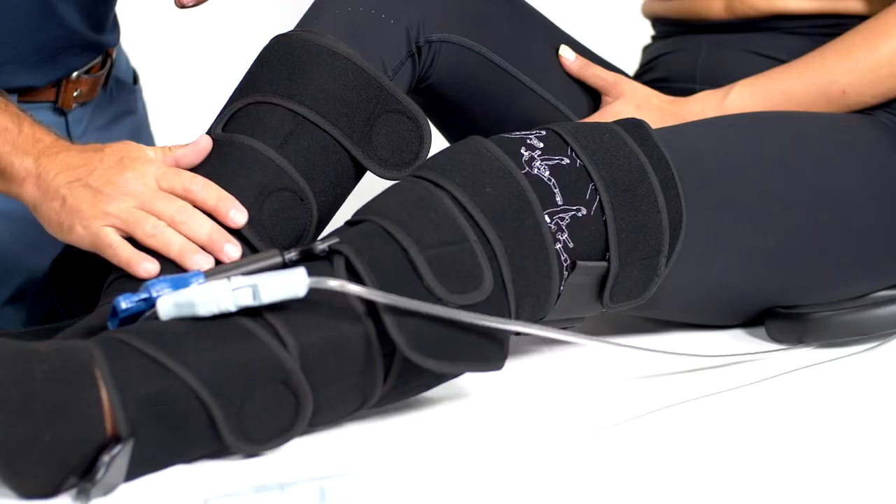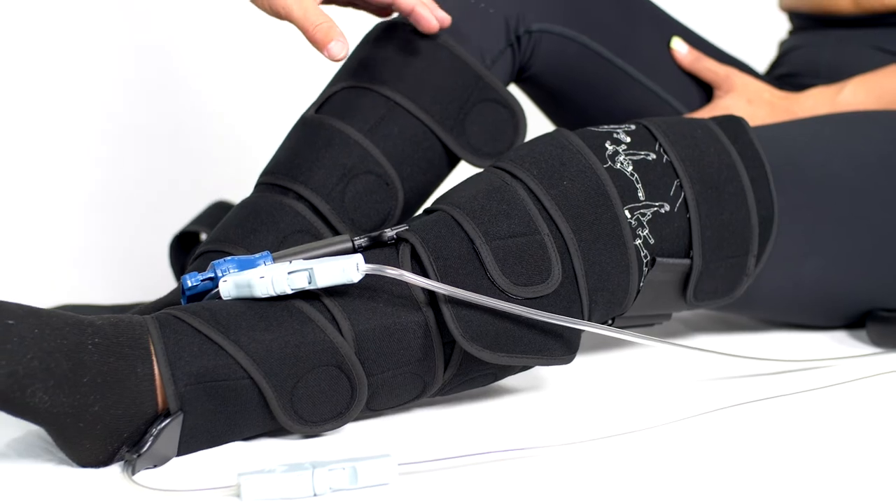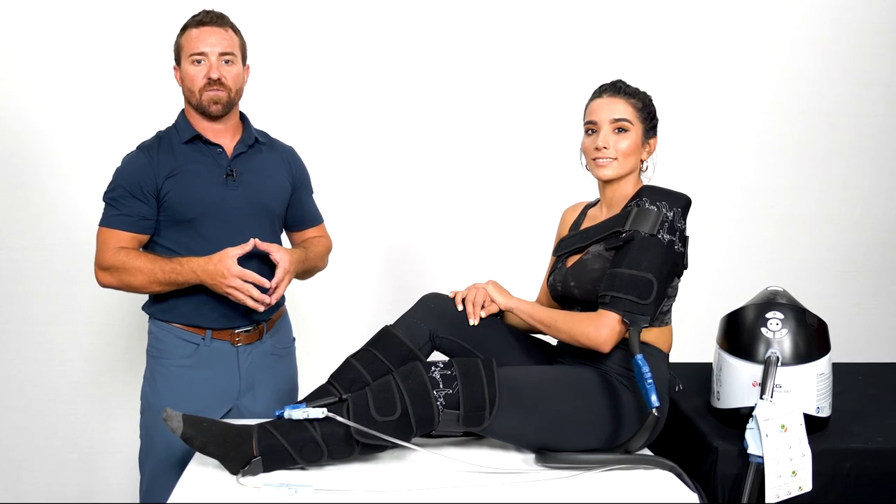The calf wraps simply velcro right around the lower leg. Now that we have our pads in place and we're connected, we're ready to begin treating and on our way to recovery.